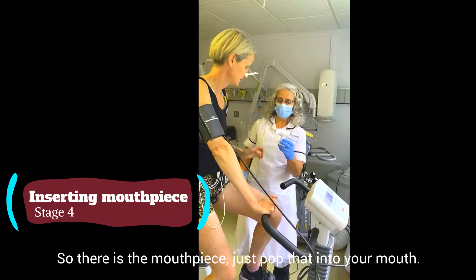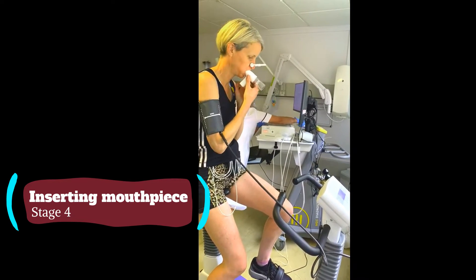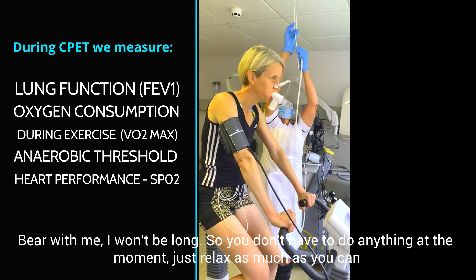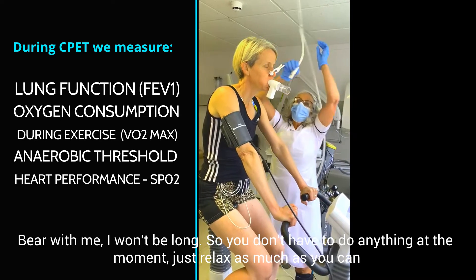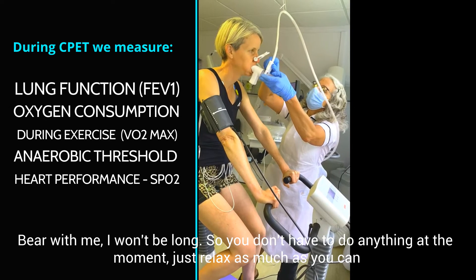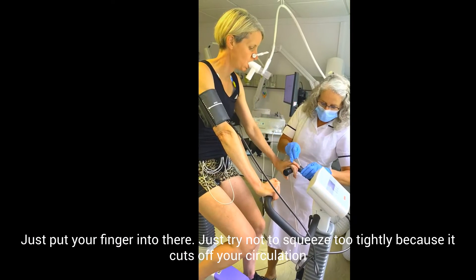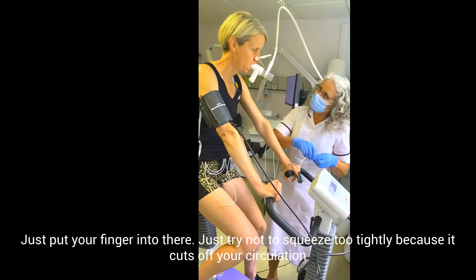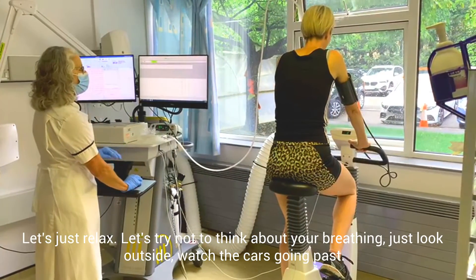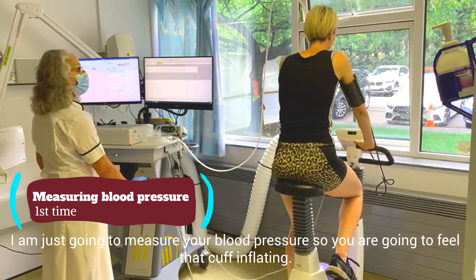So there's the mouthpiece. You don't have to do anything at the moment — just relax as much as you can. And then we need to pop this onto your finger. Just put your finger in there; try not to squeeze too tightly because it just cuts off your circulation. Just relax. Try not to think about your breathing — just look outside and watch the cars going past. I'm just going to measure your blood pressure so you'll feel that cuff inflating.